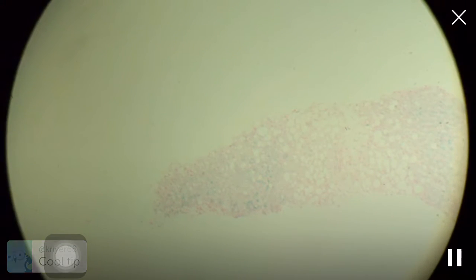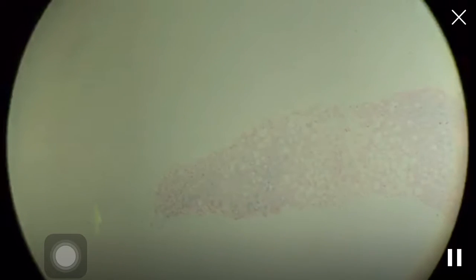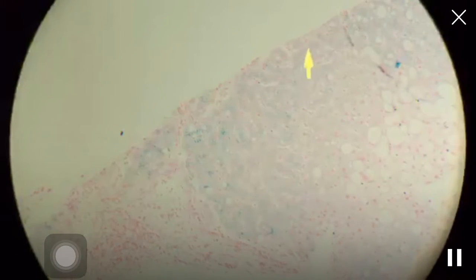Now there are two kinds of iron staining we're seeing here. One is coarsely granular iron, and that's the iron that we call hemosiderosis. The histologic feature, this is how I use the terminology, the histologic feature is hemosiderosis. The clinical condition or syndrome is hemochromatosis. So there is periportal hemosiderosis, and then there is also this pale blue blush to the tissue. That's ferritin.